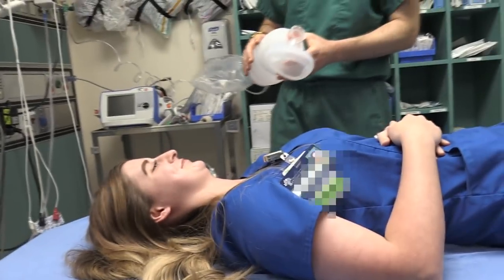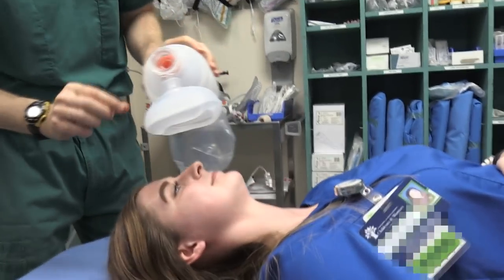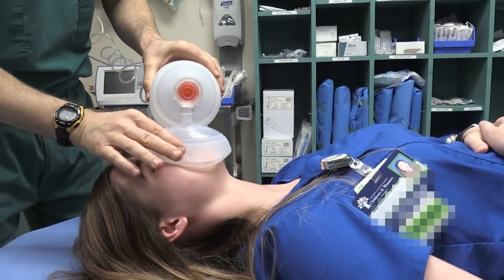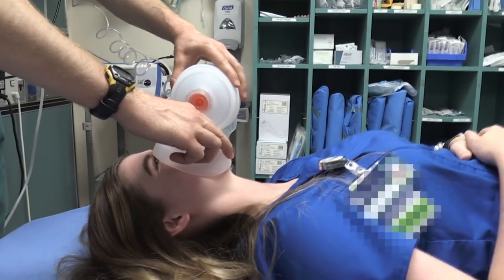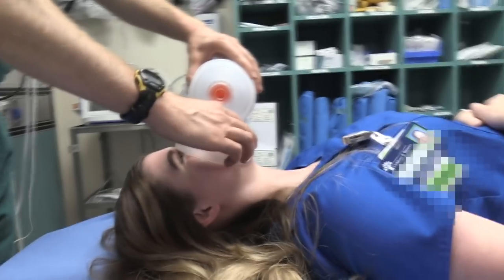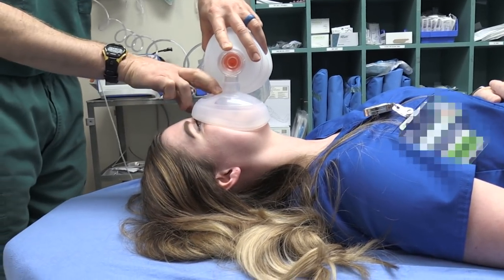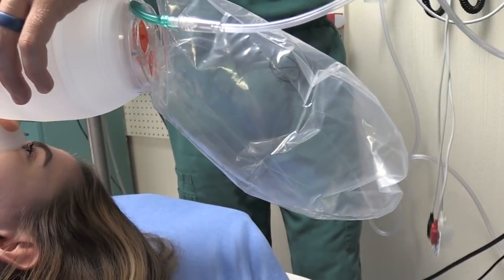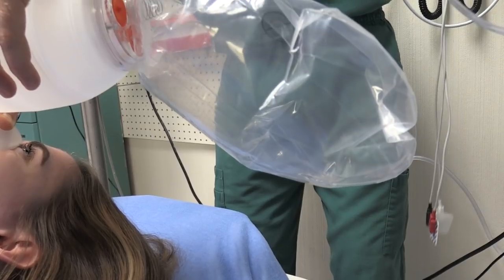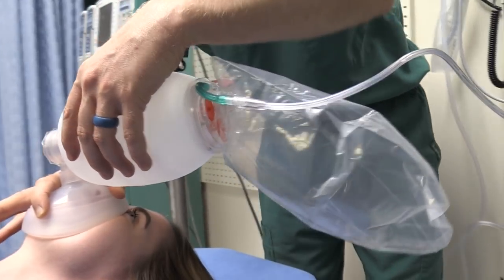Emily, you want to be our patient here? Sure. So you're not going to bag for it. You're just going to put the mask right on her face, and you tell us how it feels. If you get claustrophobic, tell us. Now go ahead and breathe and tell us how that works. Bring your head back. So are you having any trouble breathing through that mask? None at all. So as she breathes in and out, this would be an excellent tool for pre-oxygenation. You can see the bag is moving in and out.